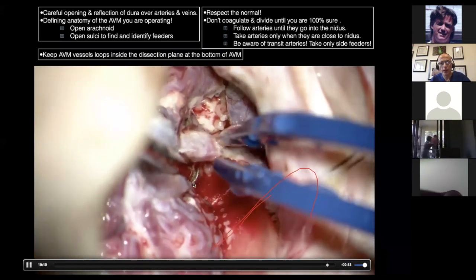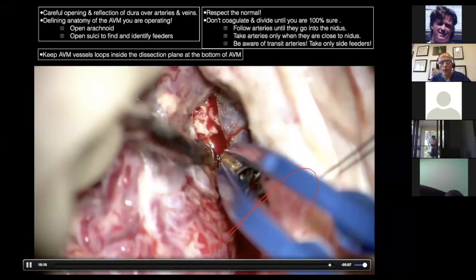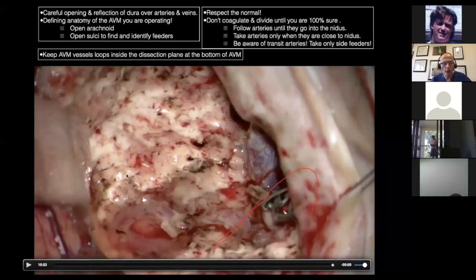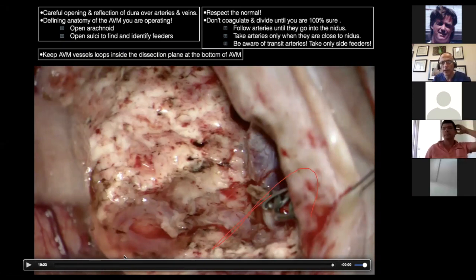And lastly, I am taking the draining vein and I always put a clip. So, and then you do your hemostasis, okay? And stop for 10, 15, or 20 minutes, and whatever the patient's normal pressure, always maintain normotensive, okay? Not hypotensive, not hypertensive during the dissection. And at that time, if the patient's systolic blood pressure is normally 120, ask anesthesia to raise the blood pressure to 150. And after you are satisfied with your hemostasis, wait 15, 20 minutes.